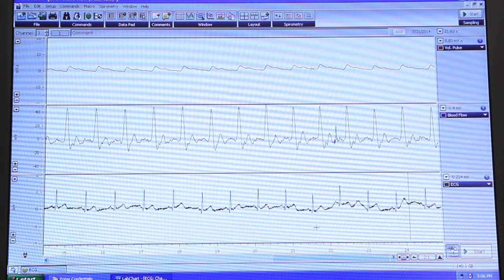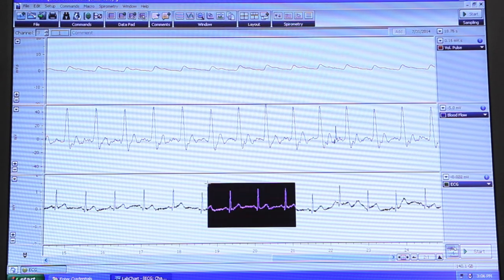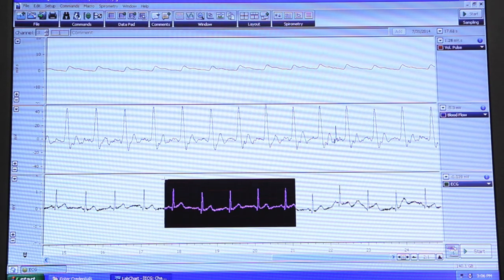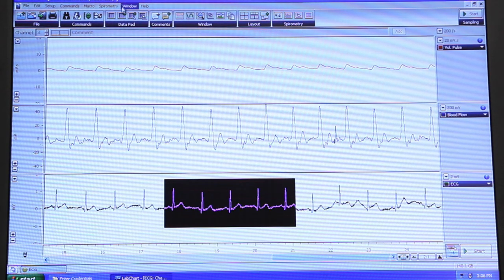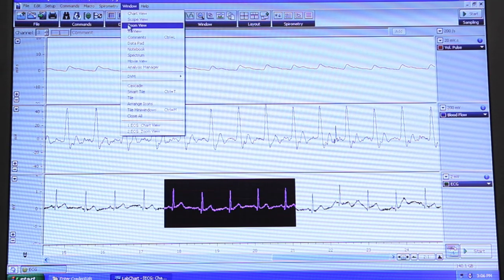Next, highlight about 3 seconds of your ECG recording by clicking and dragging the mouse. On the toolbar at the top of the screen, click on window and then select zoom view.